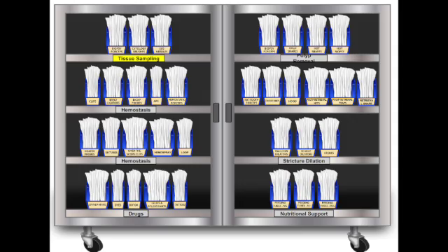Okay. Lugol's for esophagus. What else? Then you have acetic acid. This one's pretty versatile. How so? Well, it helps screen for Barrett's esophagus and any associated dysplasia. Also good for checking gastric intestinal metaplasia in the stomach. And really importantly, it helps define the true edges of difficult serrated polyps. Those can be really subtle. Right, I've heard those are hard to see sometimes. They are. Acetic acid makes the surface patterns clearer.